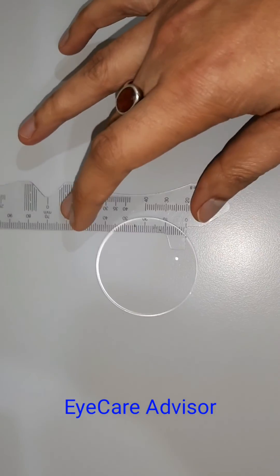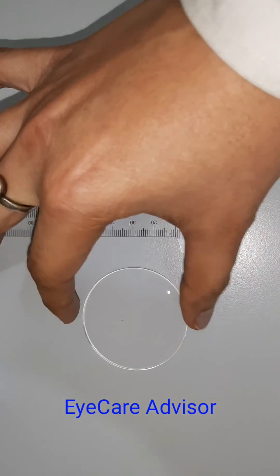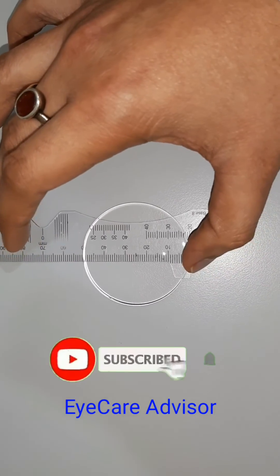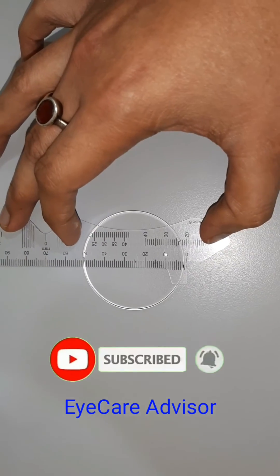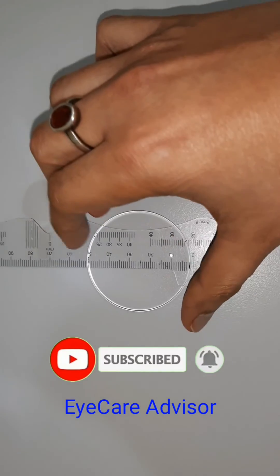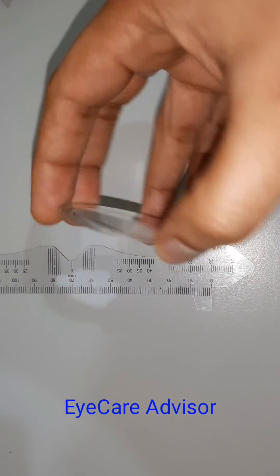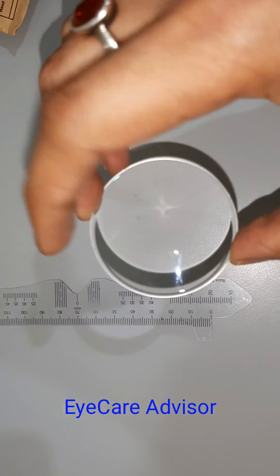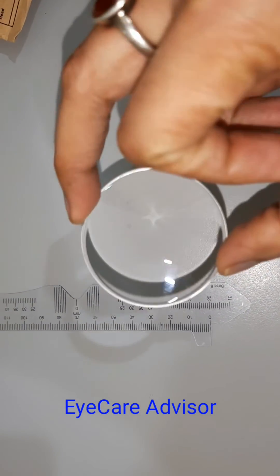I will show you the size with a scale. You can see here — this is only 50mm or 5 centimeters. This is a very small diameter lens, and generally you will not see this small diameter lenses, but we ordered this specifically to make the thickness of the lenses less.